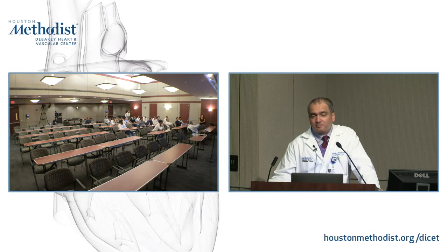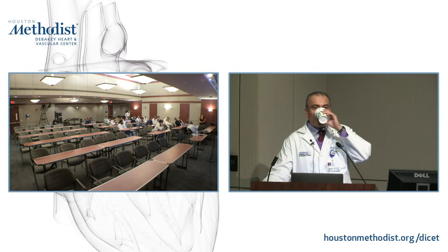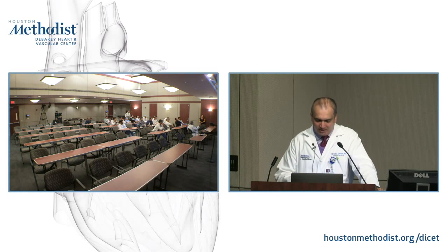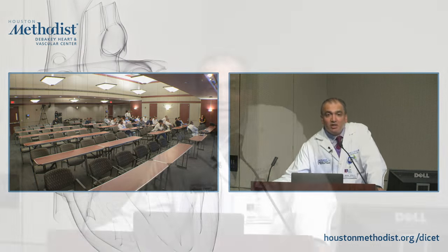The question is, in acute myocarditis, is the hyperenhancement infiltration, inflammation, edema, or scarring? Do we know a little bit more about it? Are there any serial studies showing that it goes away or that it stays? I had a slide that I took out because of time. The reason you get hyperenhancement is basically there's an expansion of the extracellular space, and that space is expanded because of myocyte necrosis as well as an inflammatory process that occurs.